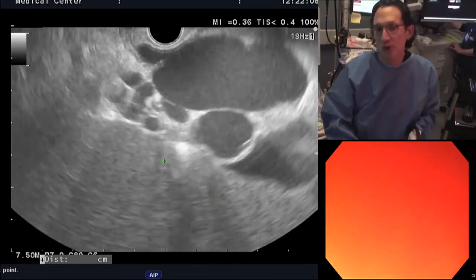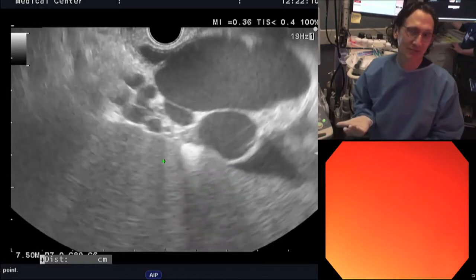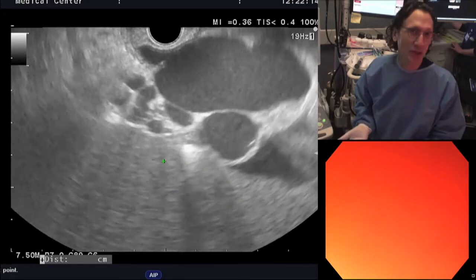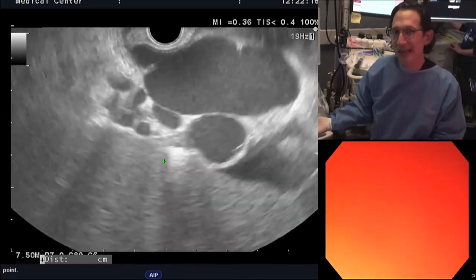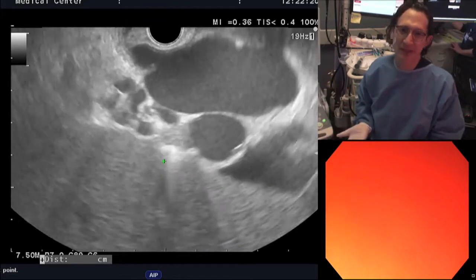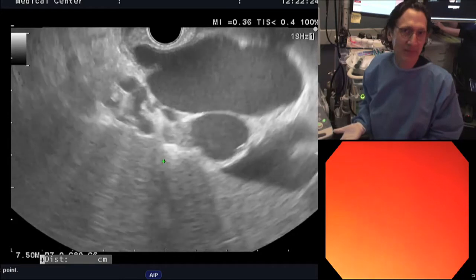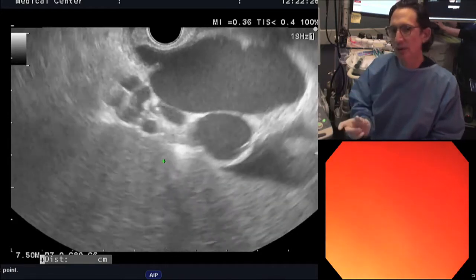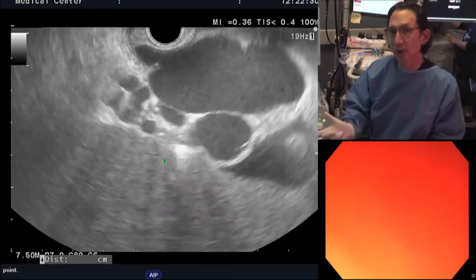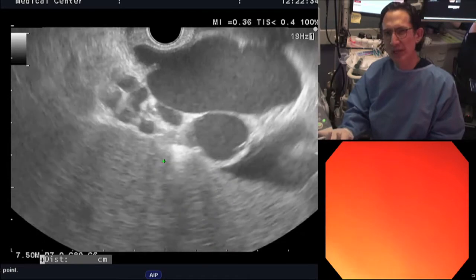So our coil, the largest coil we have, has a diameter of 2 centimeters. In fact, I wonder what a radiologist would put in something like this when they do their treatment, because we're using the same coils that the radiologists use. The largest size is 2 centimeter diameter. So you look at the diameter of the coil and you look at the length of the coil. Now the length of the coil also goes up to, I think, 2 centimeters.